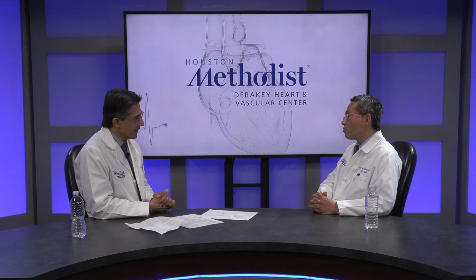I know you've done a lot of work even in the realm of heart failure patients who have LVADs. Yeah, it's a very small group of patients, but we believe that since patients have an assist device, oftentimes the echo imaging has a lot of problems because of the acoustic shadowing, and MRIs cannot be performed in patients with LVADs, and CT in selective cases because we have to be cognizant of the renal function and also age of the patient.